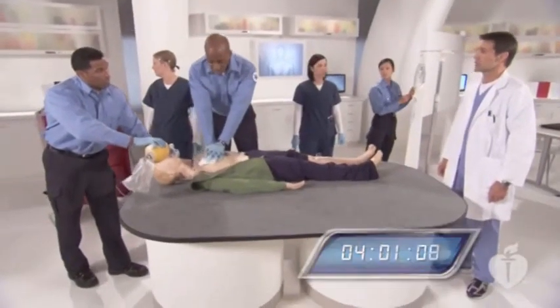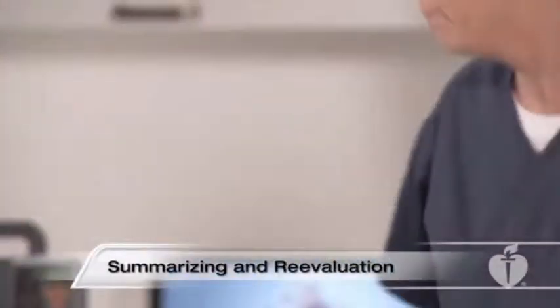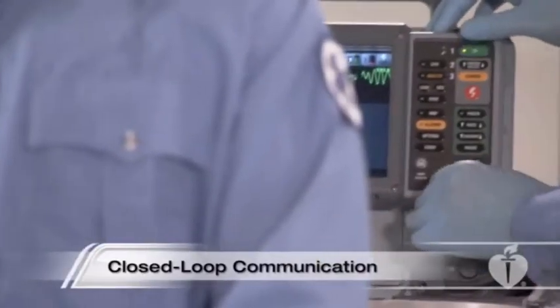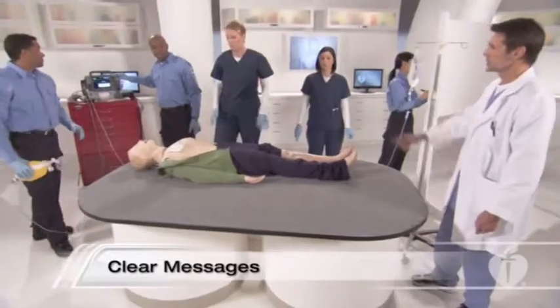2 minutes. Okay, let's analyze. Switch roles. Okay, the patient is in persistent VF. Let's shock again at 360 joules. Charging at 360 joules. Shock ready, clear the patient. Shocking on 3. 1, 2, 3. Shocking. Shock delivered. Continue CPR.